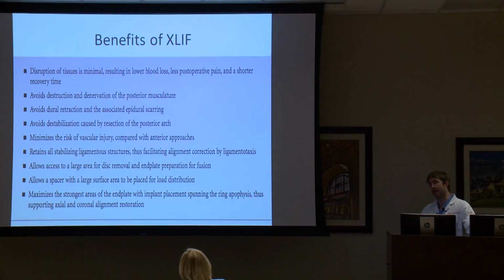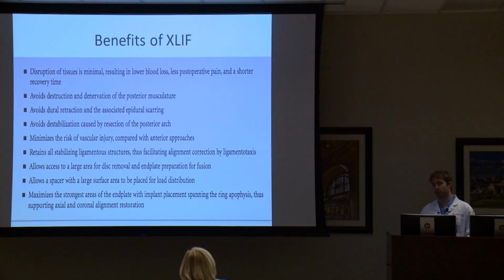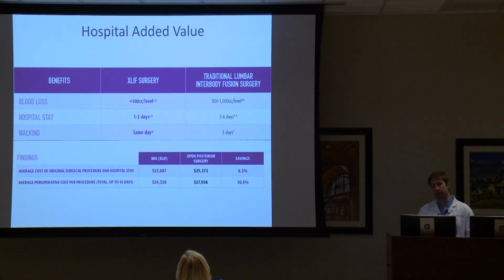It minimizes the risk of vascular injury because we're not coming from the front. And then, like I said, you retain all your structures, so you're keeping a nice compact area in which you're working, and that's nice. And then the biggest thing is obviously allowing for a large area of disc to be removed and replaced with some kind of graft, which hopefully will facilitate bony fusion. And so that's nice.